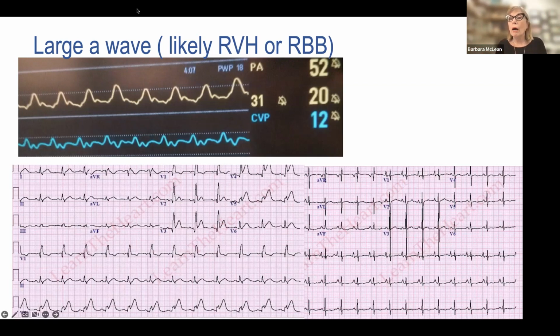I can just say, oh, is there evidence of right ventricular hypertrophy? Meaning that on the right sided lead in V1, you have current coming to the right. That gives you that upright wave. That is your R wave. You should never have an upright wave in V1. If you have an upright wave in V1, the next step is, is it wide or is it narrow? This is narrow. So upright wave in V1, as long as your electrodes are on correctly, and of course you need to make sure of that, this is right ventricular hypertrophy.